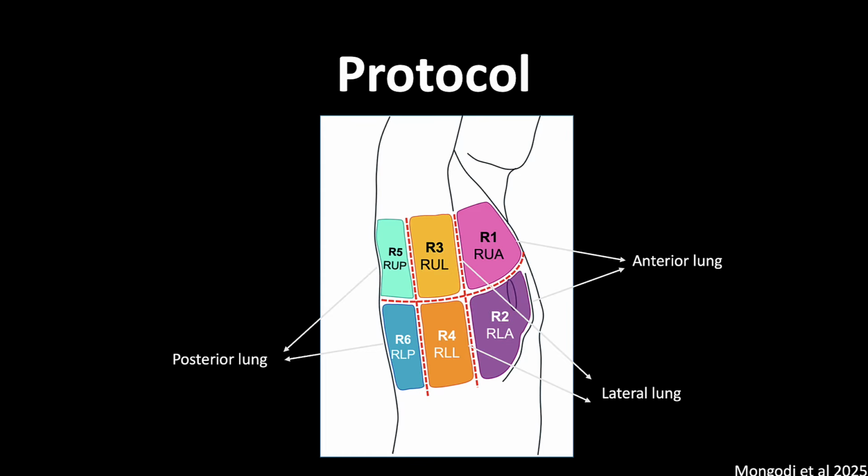For the rest of this screencast, we will be talking about how to perform comprehensive lung ultrasound using this 12-zone protocol. I will also be describing the use of the abdominal preset on the phased array probe. R will refer to points on the right side of the chest, while L will refer to points on the left side of the chest.